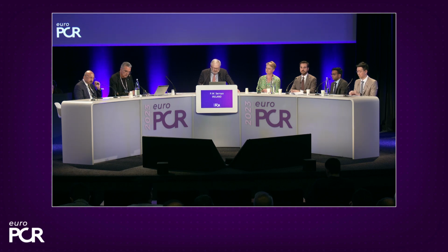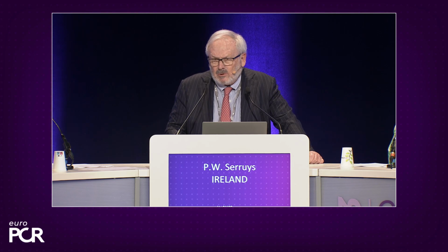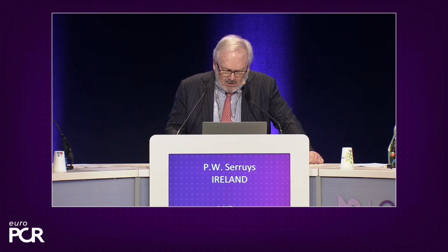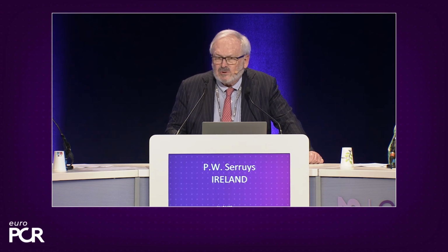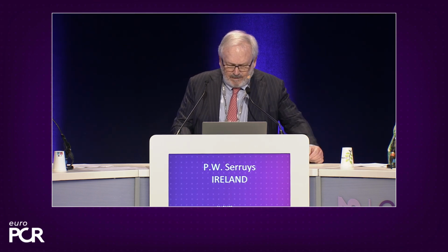We will see at some point how we use the intracoronary imaging, probably at the end of the case to optimize the left main if it has to be optimized. And we will use in this case the OFDI of Terumo. And we are very fortunate to have a great expert in the cath lab in Toulouse, that's Professor Yoshinobu, also from Galway, which will analyze the OCT for us at the end of the procedure.